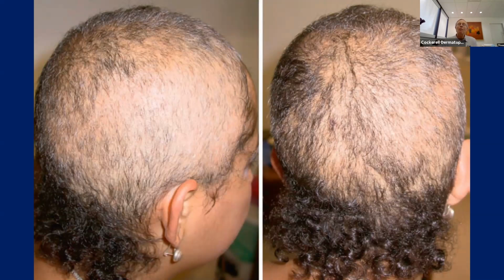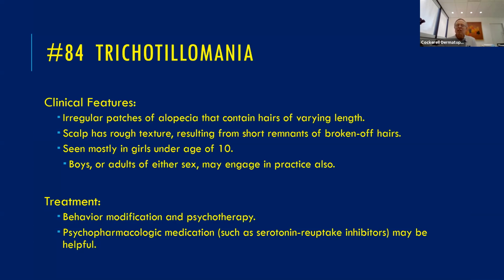And I think on something like that, they would probably give you something even more impressive than just one or two broken off hair shafts. We're trying to get these unknown slides and cut multiple sections. Sometimes it's hard to get areas that show multiple areas with trichomalacia. So that's a good thing about digitized slides. They can show you a perfect example that everybody gets to see. So they'll find a good one that's got lots of trichomalacia in there, and that's pretty classic.